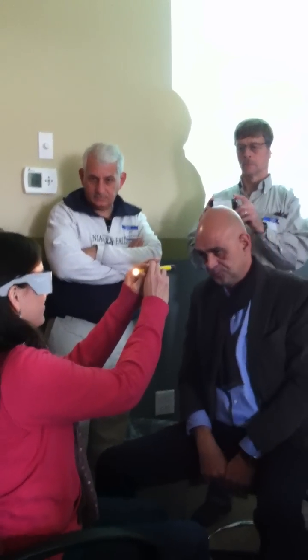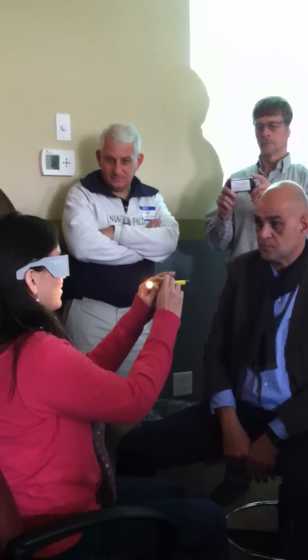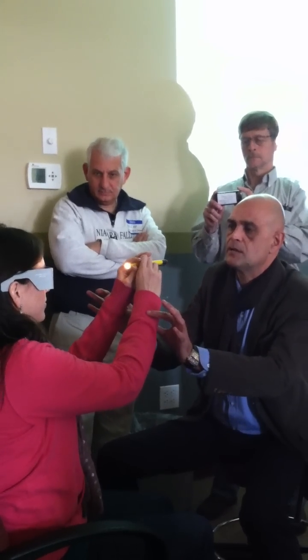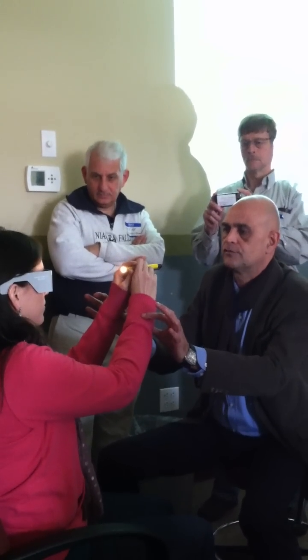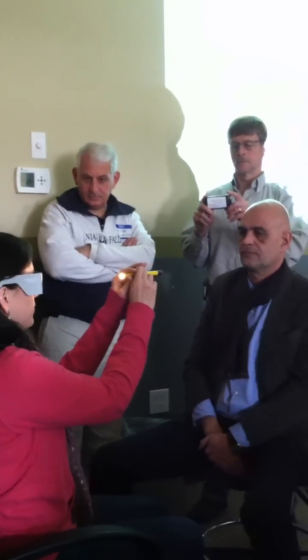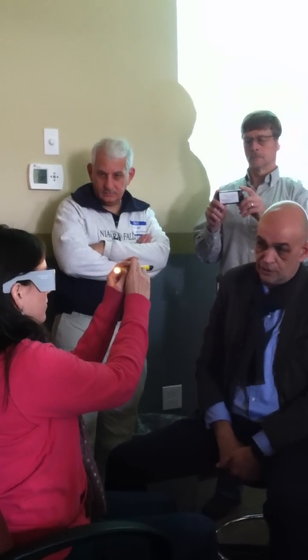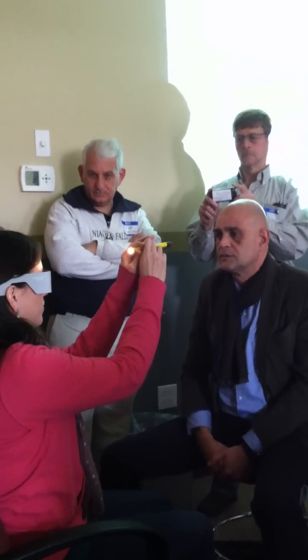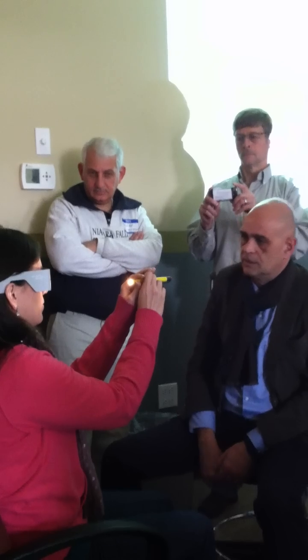Now it's up. And breathe. And then you come in the middle. And then we do the same thing. That's far enough. And that's far enough. And then you do it again — vertical. And then we do the horizontal.